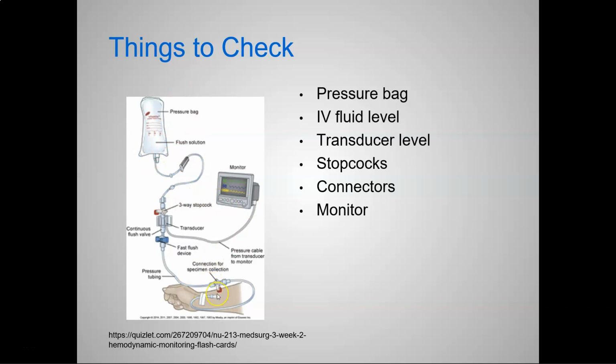And I'm not infusing any medication through the arterial line at any time, ever. Only collecting specimens, collecting blood, collecting arterial blood gases, absolutely, but nothing else.